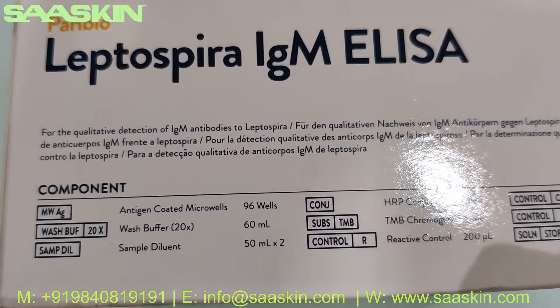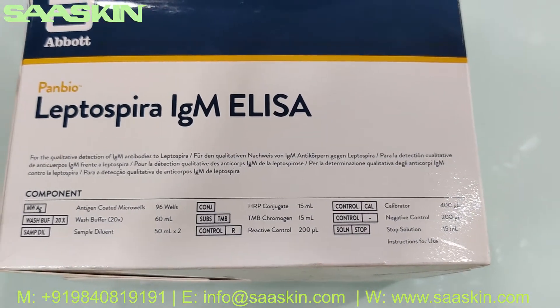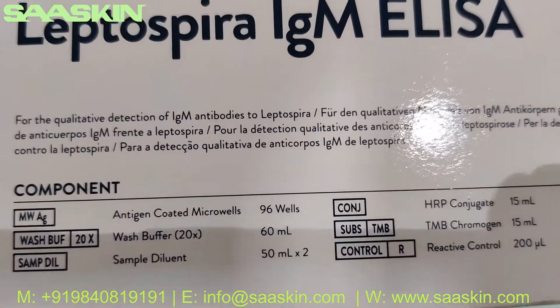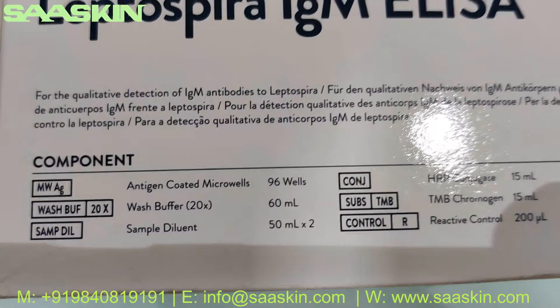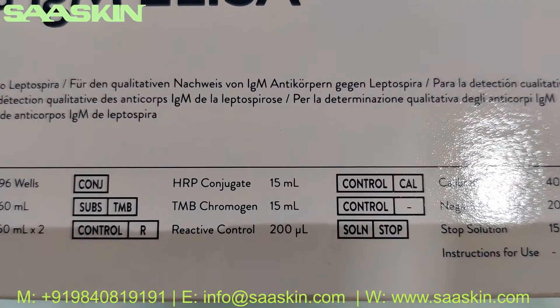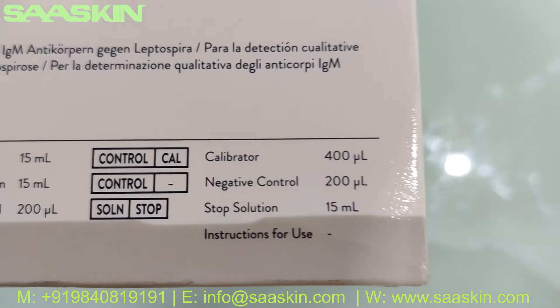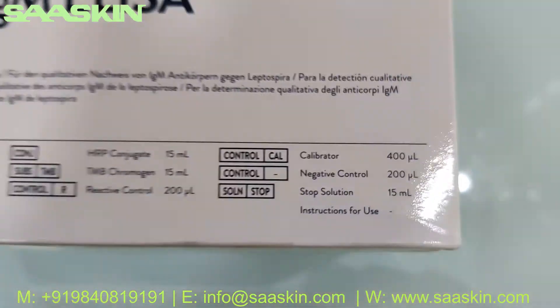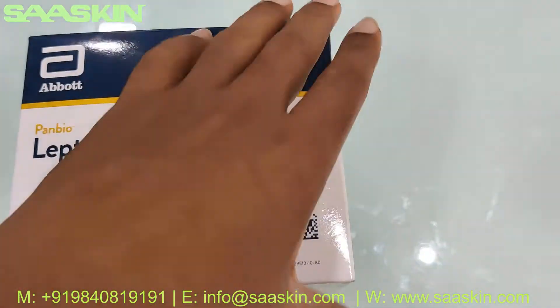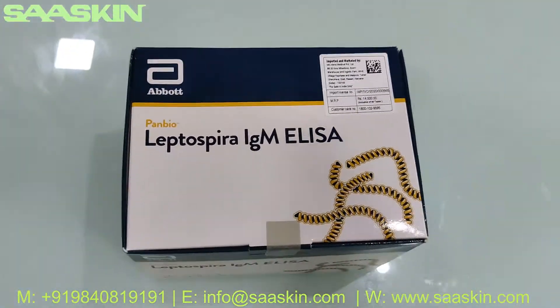This gives you an idea about the contents inside. As I said, it's a 96-well kit. The key components inside this box include the well plates, wash buffer, sample diluent, conjugate, chromogen, positive reactive control, calibrator, negative control, and stop solution.